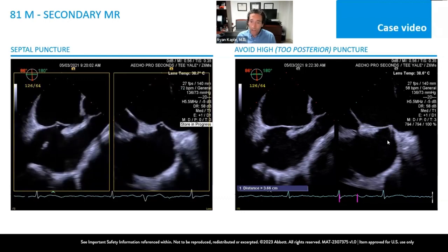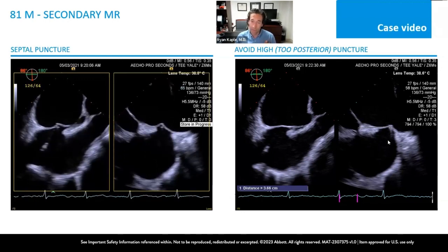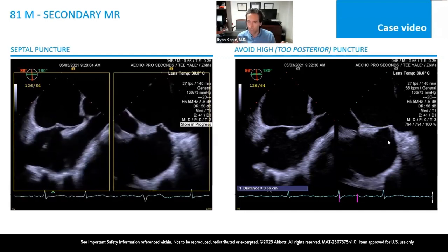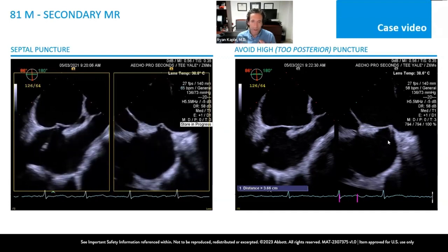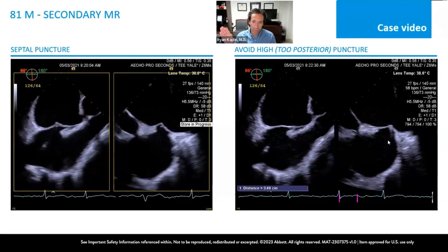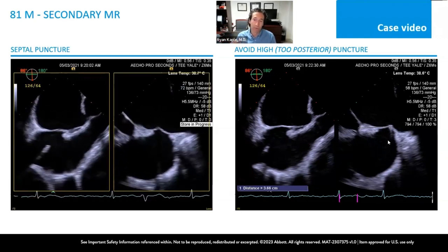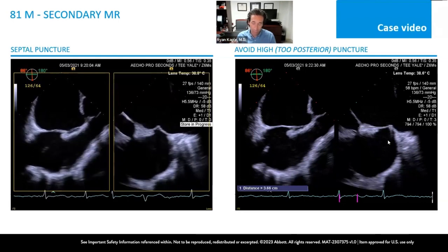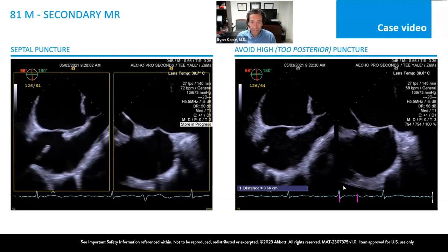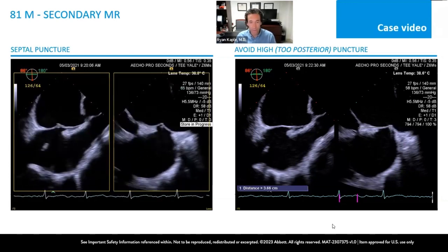And one way to give yourself more room posteriorly is to come to the mid-septum if you're talking superior to inferior, because the fossa is oval and circular. If you're too superior, you may run out of room when you're coming posterior. So come down to the mid-septum, and then you should be able to maximize that posterior, which is clockwise rotation on the needle. And again, taking your time, making sure that it's a good height and that it's safe before you go across.